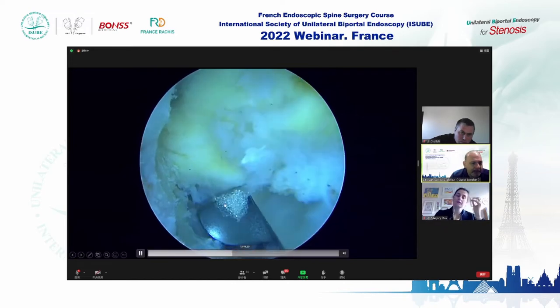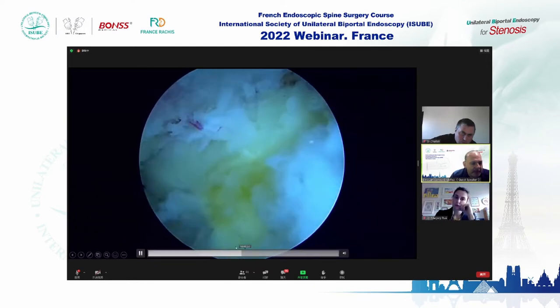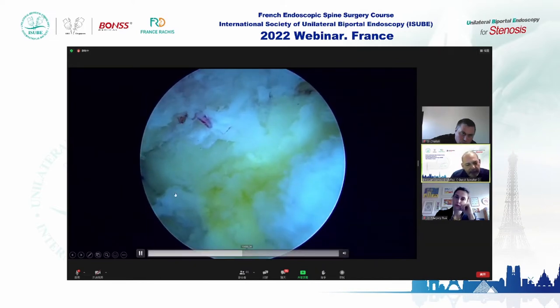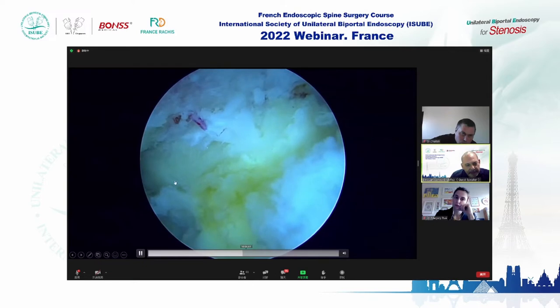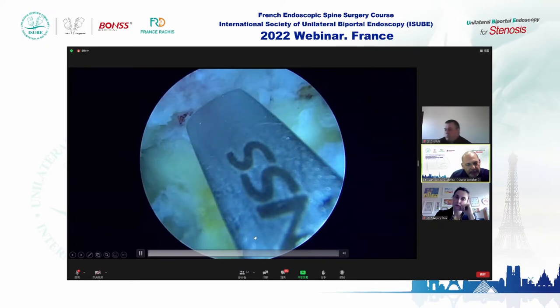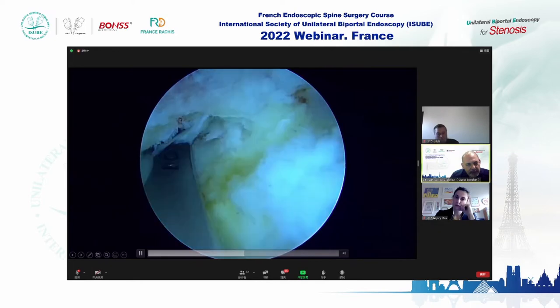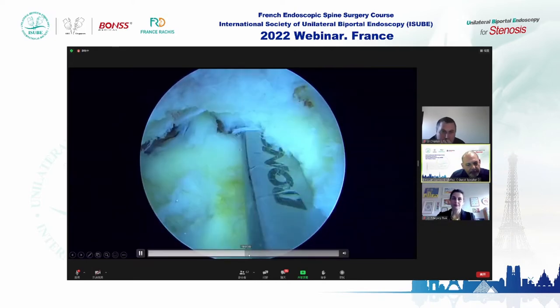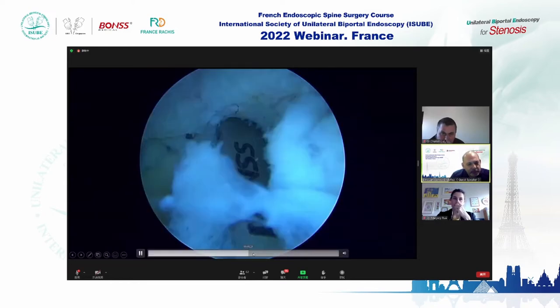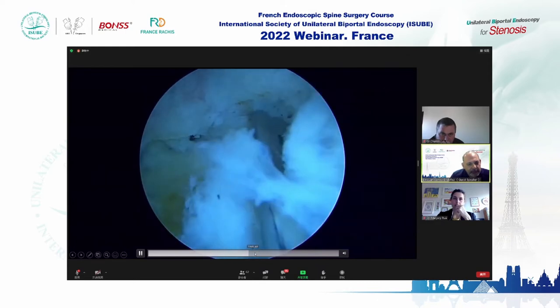Before entering the operating room with this patient, I performed a sacroiliac joint test to localize the pain. We then used the UBER technique to decompress. This was a left-sided stenosis, and here we are attaching — detaching — the flavum ligament.